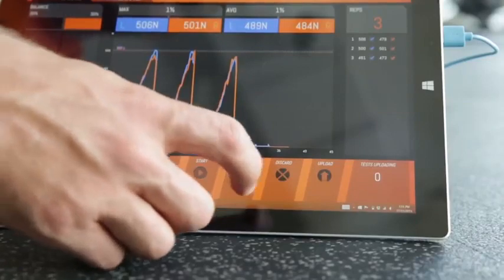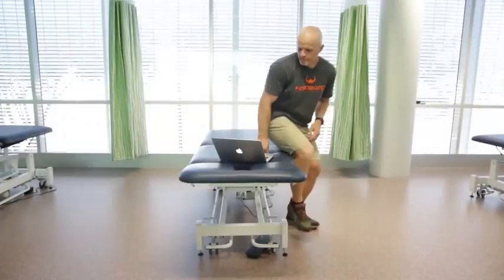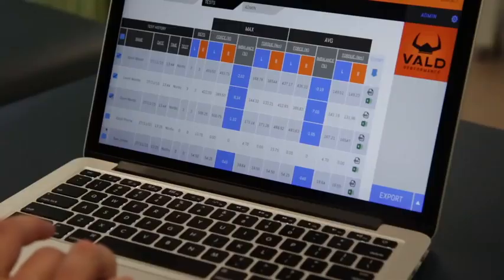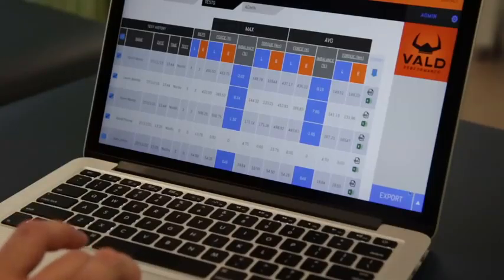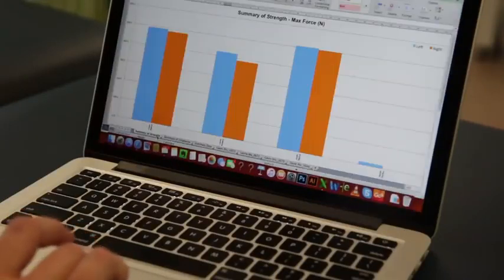When a test is completed, it can be uploaded to Dashboard, our cloud storage platform. From Dashboard, coaches can view, export and manipulate their athletes' data and import it into their existing analytics platforms.